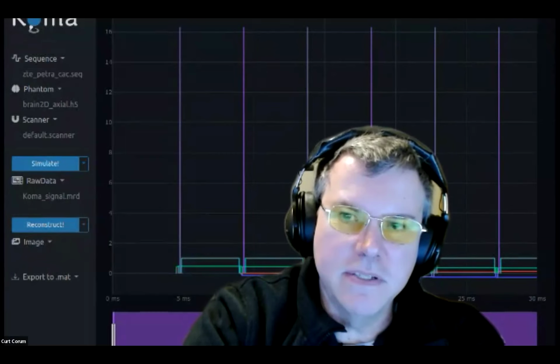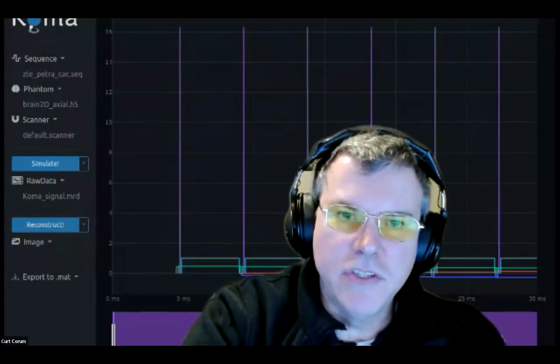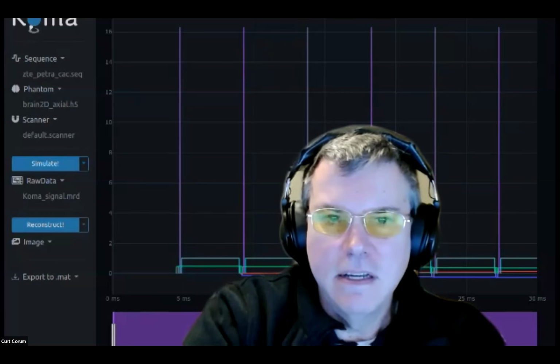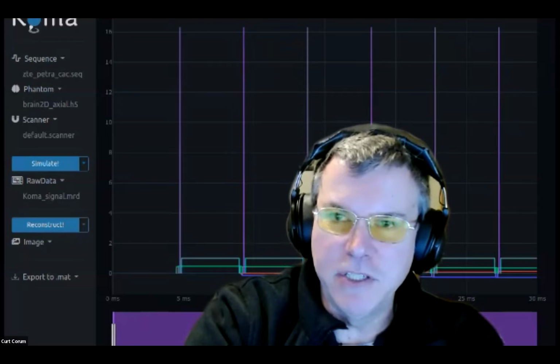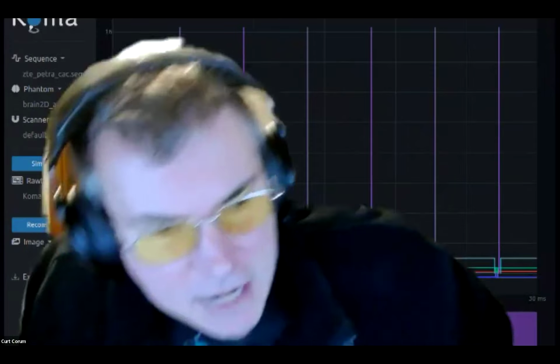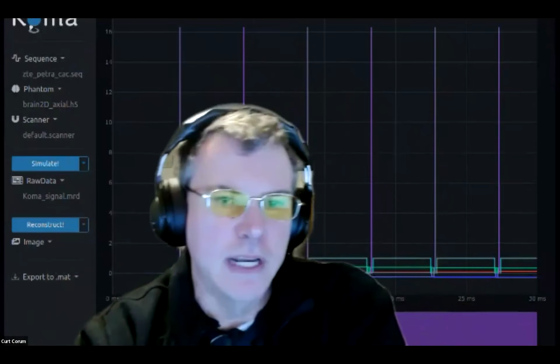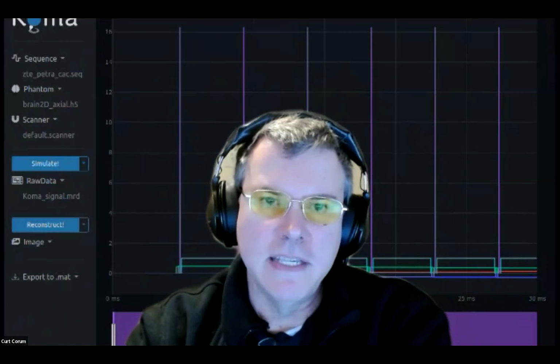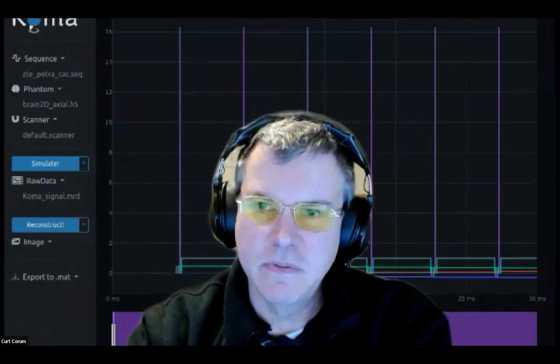It seems like you were selecting just different fixed changes to the delays. So there's still a fixed frequency that the sequence was running, but you were avoiding the specific resonances in the system. Was that true?